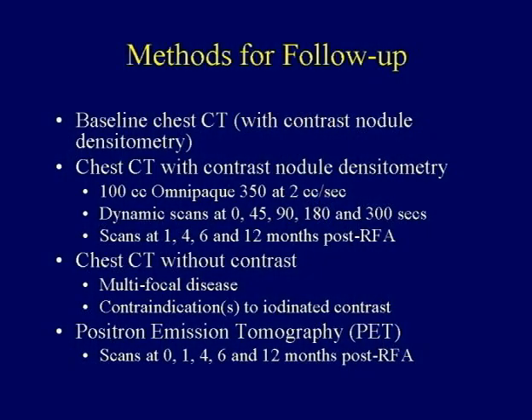And densitometry, the Swensen approach, was modified and used in trying to see whether the contrast uptake profiles changed. Another way was to obviously have to do a multifocal CT looking for metastatic lesions. And then you have to also think about the fact that maybe PET has a role here, as we saw in the workup of the primary nodule. So we think that there's a role for PET in the activity of the lesion post the burn, and we'll have a look at some of those techniques.